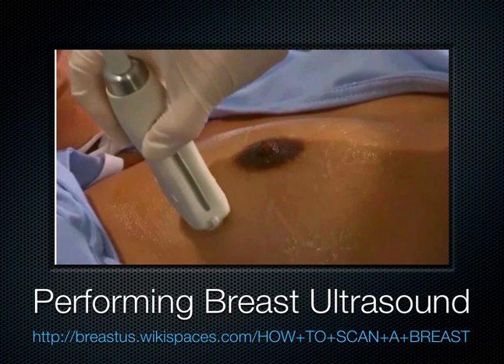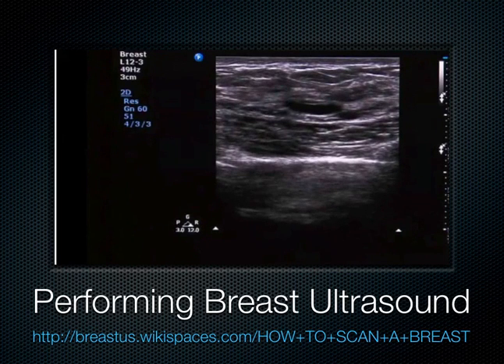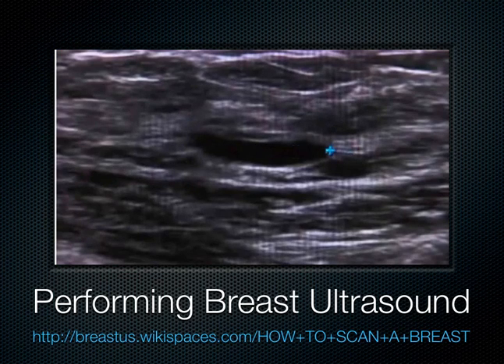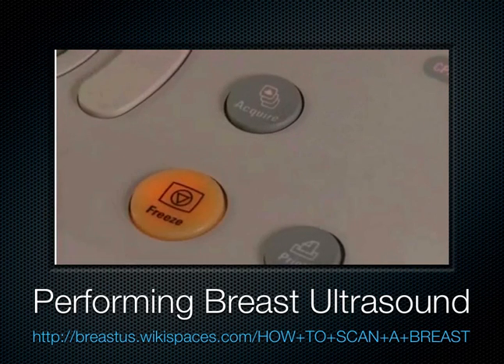Rotate the transducer to the transverse plane of the lesion. Freeze and annotate the image. Measure the width of the lesion by placing 2 calipers on the medial and lateral margins. Save the image and unfreeze to continue.